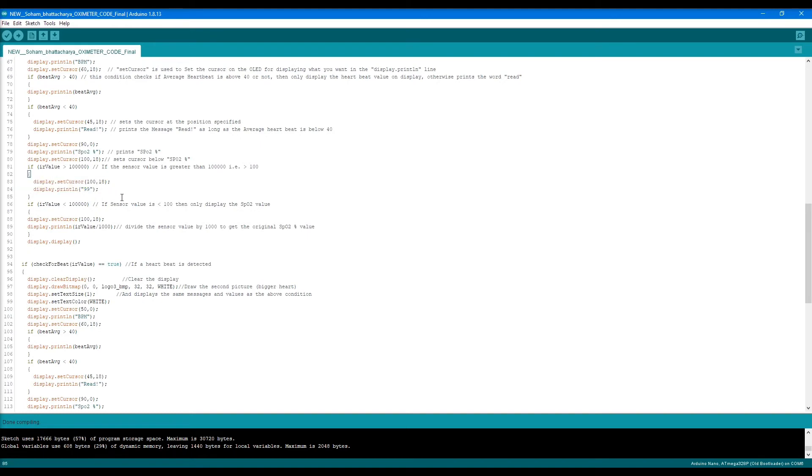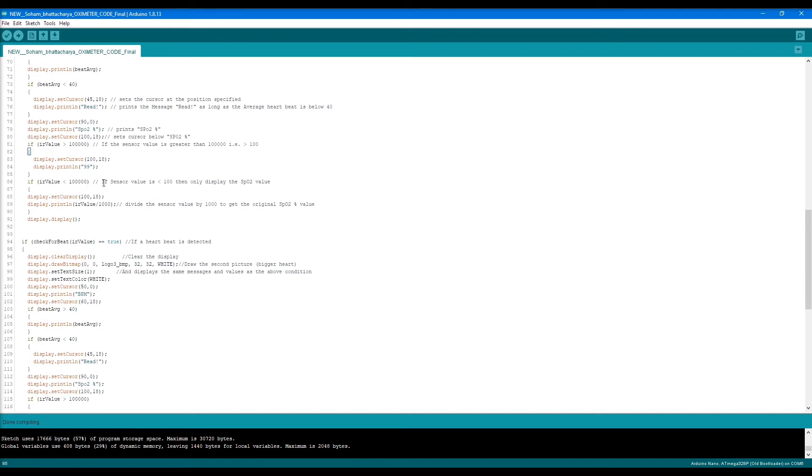Why I've done this is because the SpO2 values go beyond 100, which is not realistic. So I've generalized that if it's greater than 100, it's 99. You can change this or omit it to get the real value.